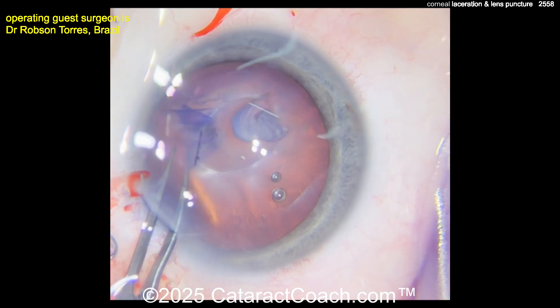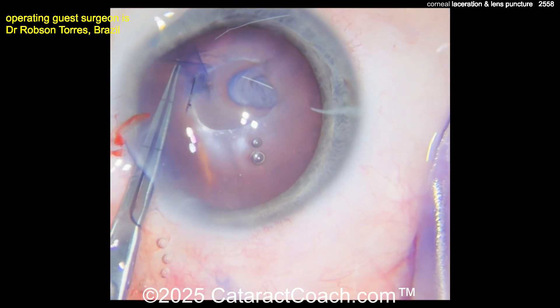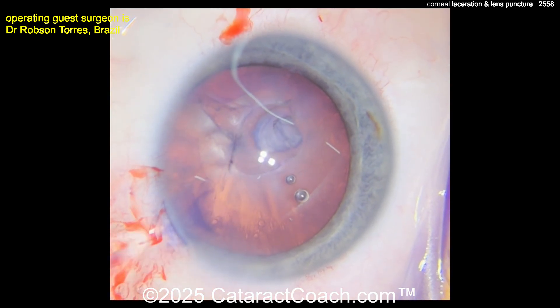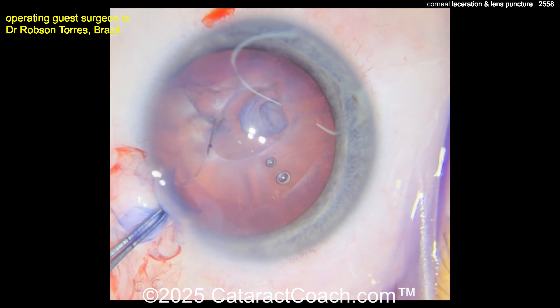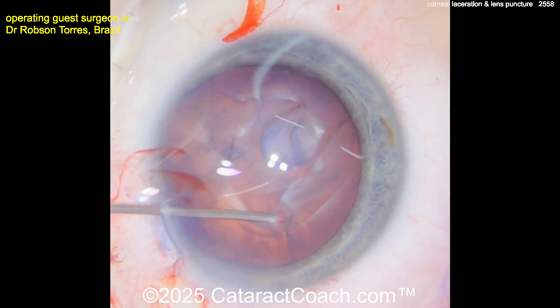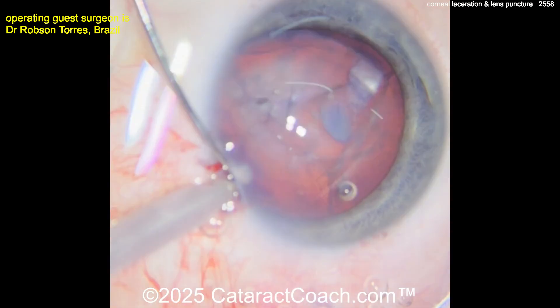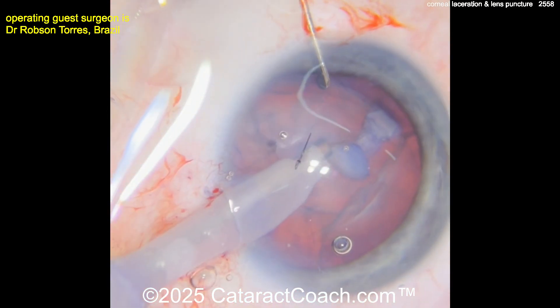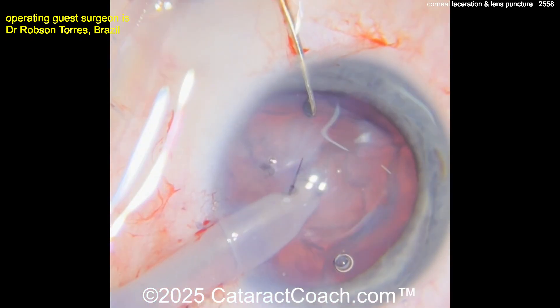Now, how do you do the lens calculations? You can certainly calculate using the patient's other eye — measure both eyes if you can. In an eye like this you could have measured it, but if the anterior chamber was flat at presentation you can't measure it as well as the other eye. Use the calculations of the fellow eye, and if you have any doubt, add a half or one diopter to the IOL power, because it's better to be a little myopic.